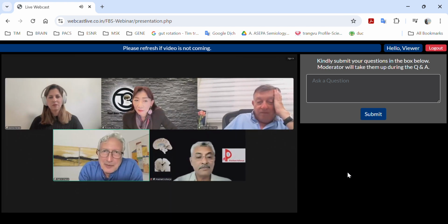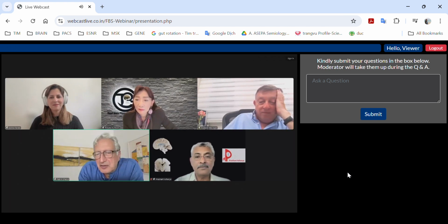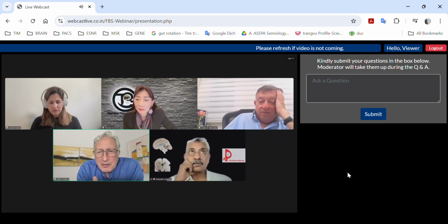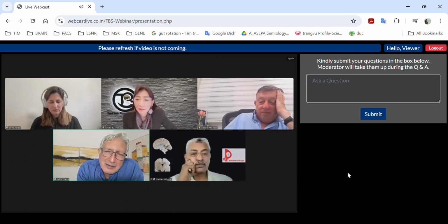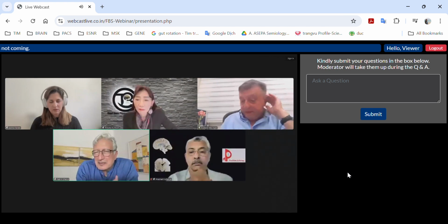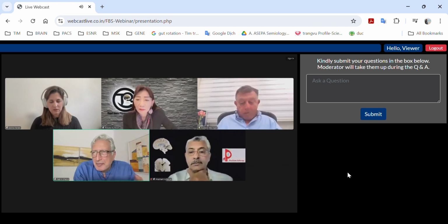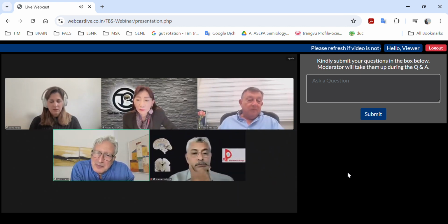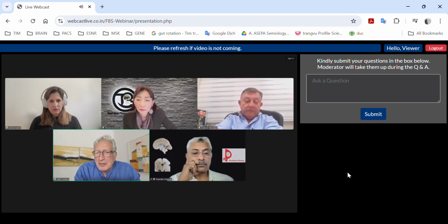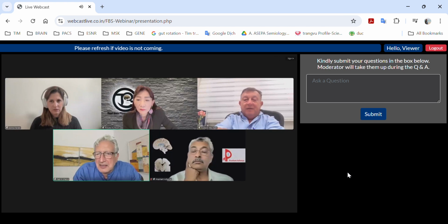I have a question for Gustavo, because when you were saying the size matters, I always wanted to ask you this question about macrocephaly. When you see macrocephaly, what is the role of the subarachnoid space? You may have a large BPD or large head circumference, but the brain size is normal, and sometimes you have an enlarged subarachnoid space, which could be familial, where the father has this. Or if it's symmetric as usual and the brain is also big, that means the brain is large, so macroencephaly. Is there any data on this?